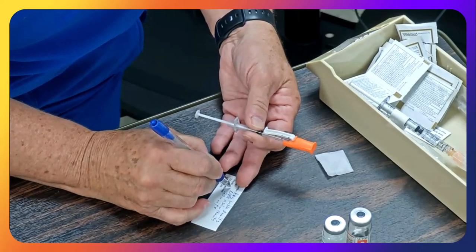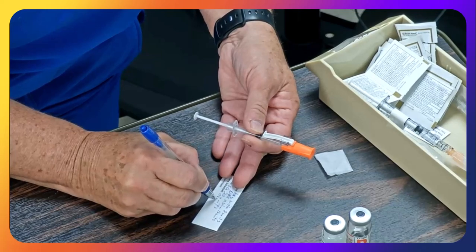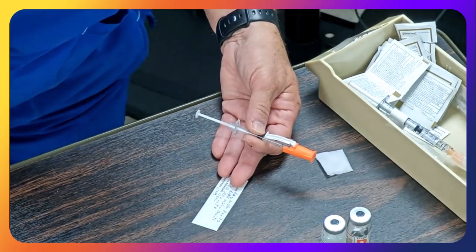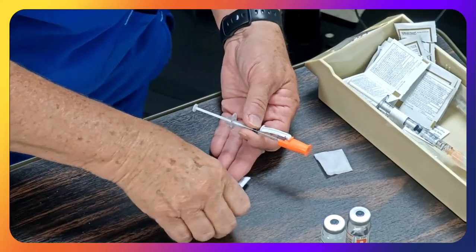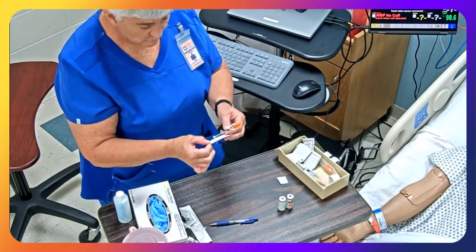And this is going to be sub-Q, okay? This is the 9 o'clock dose, and I'm putting my initials on there, okay? So regular insulin, 8 units, and NPH insulin, 12 units, so 20 units.